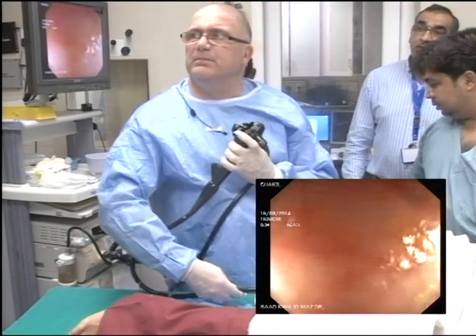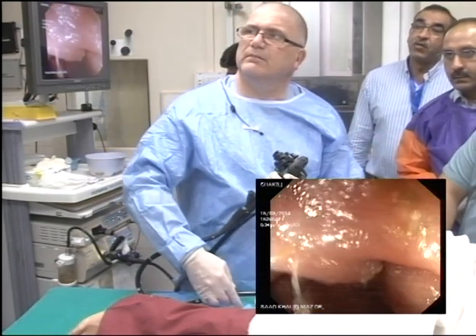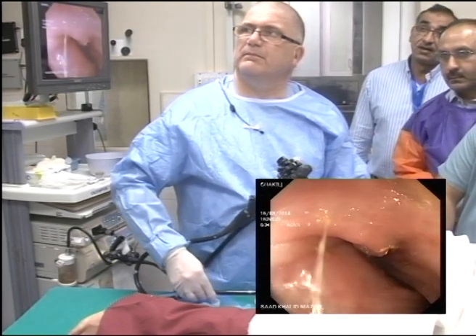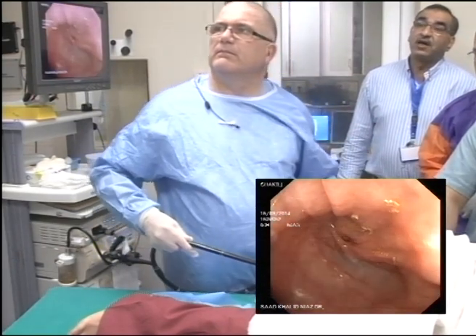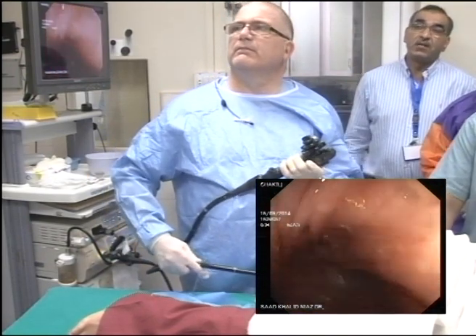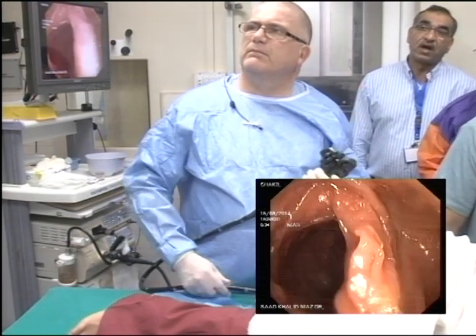I think people are more obsessed about improving their adenoma detection rate. So if you see a small polyp, less than 5 mm, typical salt and pepper, what would you do? Usually we have indigo carmine ready in syringes all the time. So I would just spray it with dye.